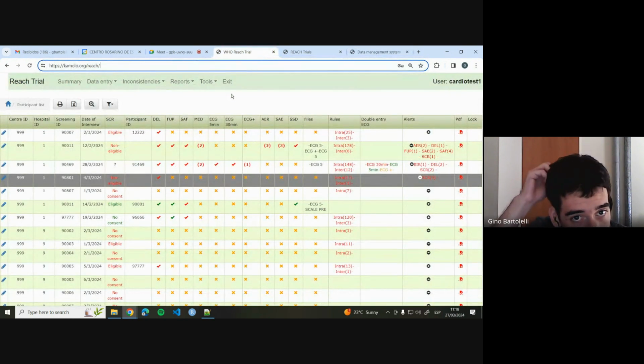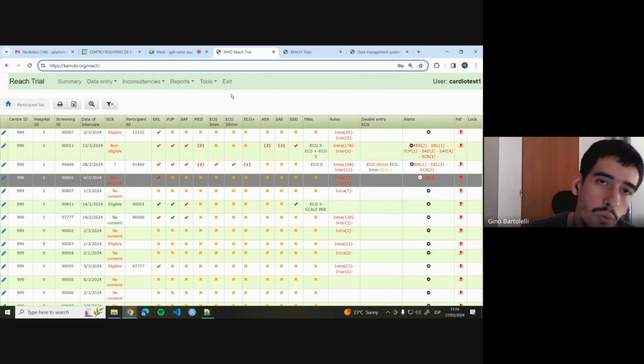So I'm going to go back to, let me see, I don't want to miss anything. So I just showed you the system manual now. I think that we can start talking about your workflow as ECG reviewers.